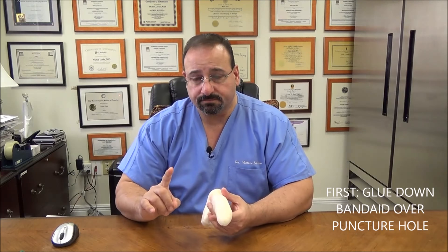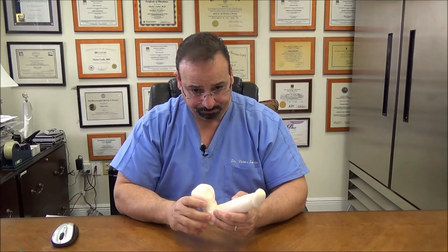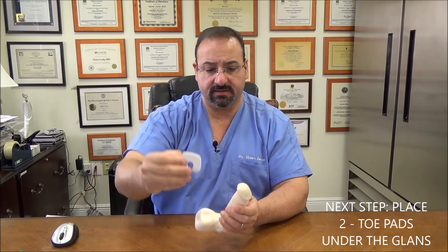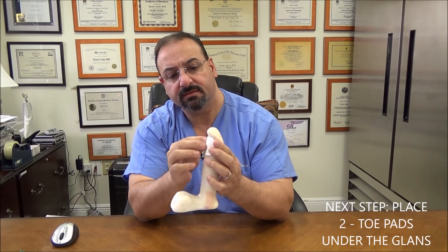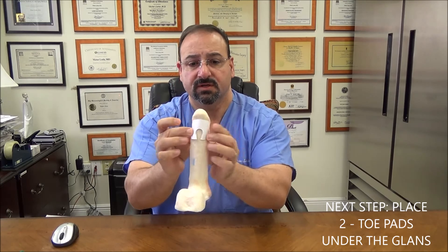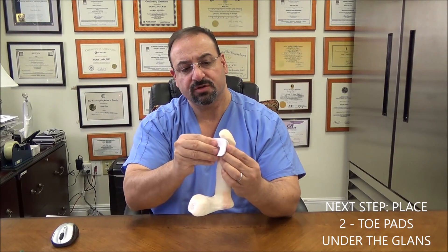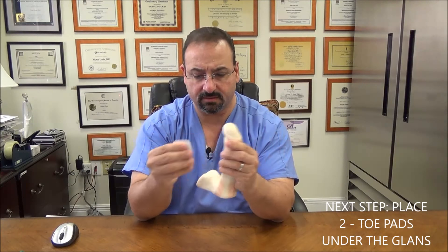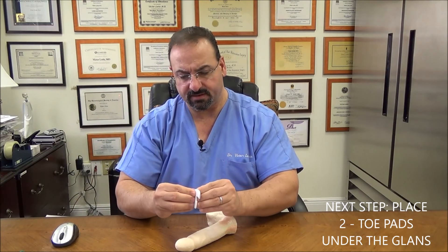Step 1: you'll notice that I made an entry point here. Step 2 is to put your toe pads — there's a toe pad — underneath the glans right over here. You're going to put 2 of them on top of each other. You could trim these a little bit if they're too big. So let me show you how to put the toe pad on.